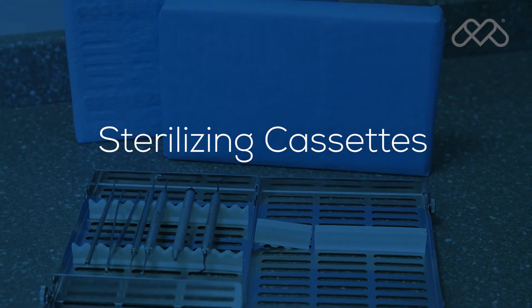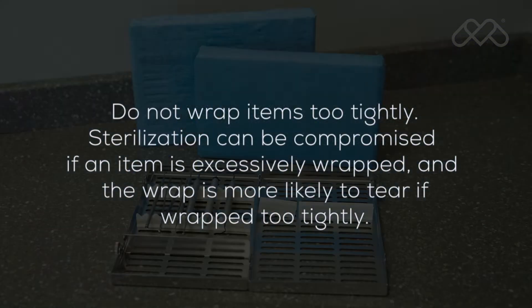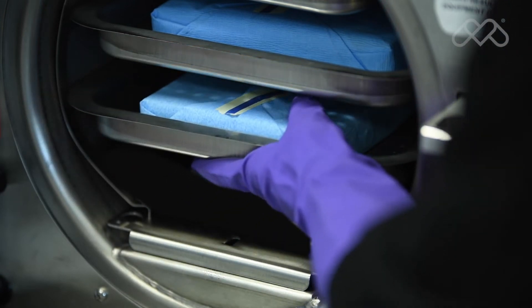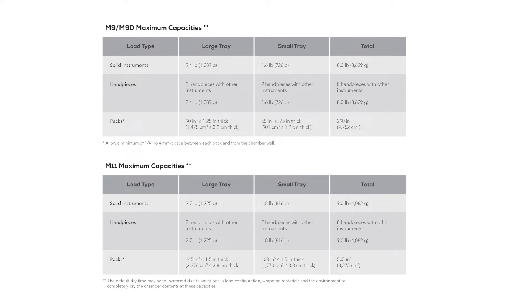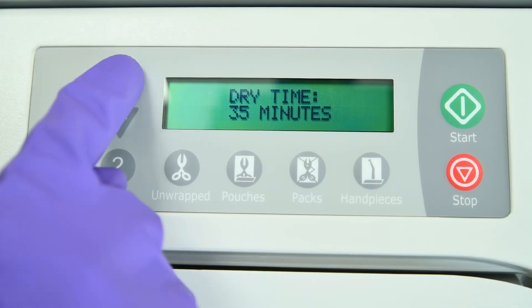When using cassettes in the M9 or M11, follow the cassette manufacturer's instructions for use. Do not wrap items too tightly, as sterilization can be compromised if an item is excessively wrapped. Cassettes can be loaded on the trays but must fit within the tray boundaries and should not touch each other, the tray above, or the chamber wall. When using the optional horizontal and vertical cassette racks in the M11, the maximum load including the cassettes can be increased to 12 pounds. Additional dry time may be required.